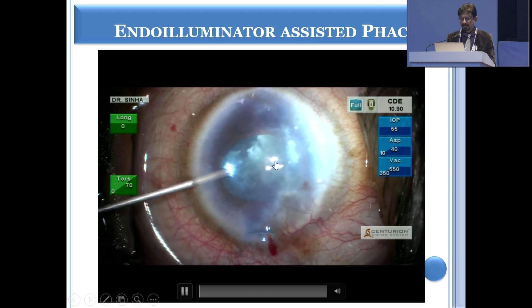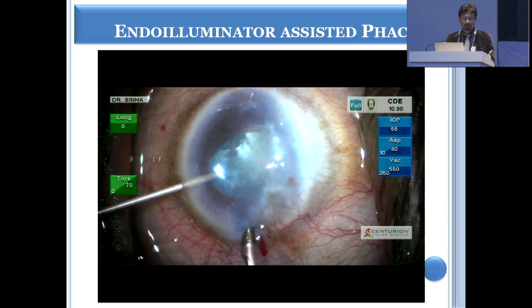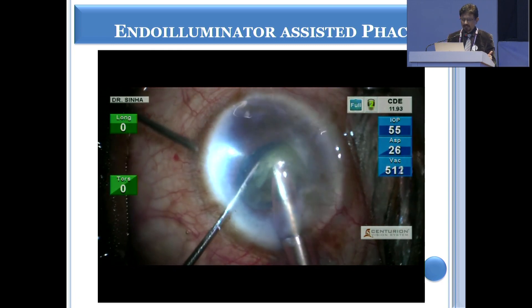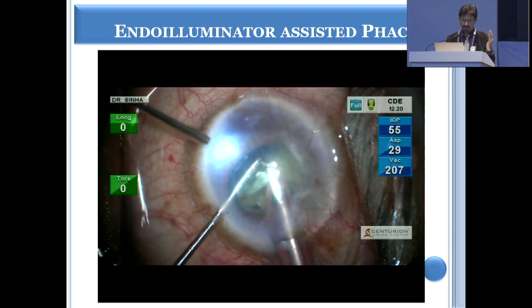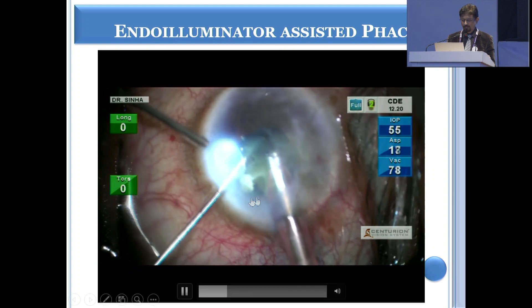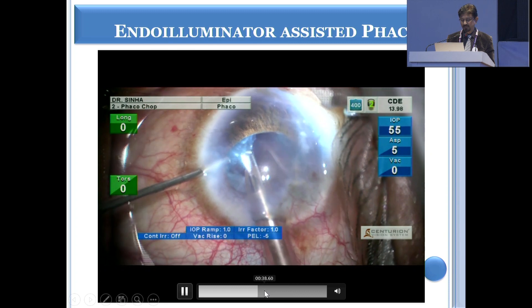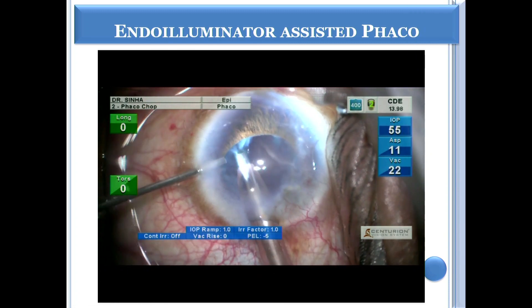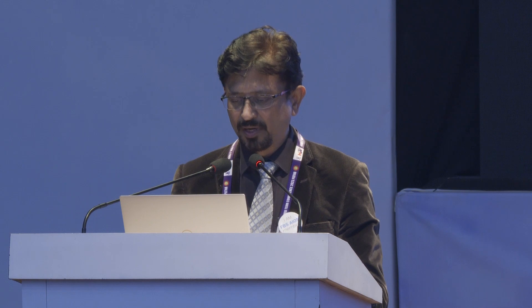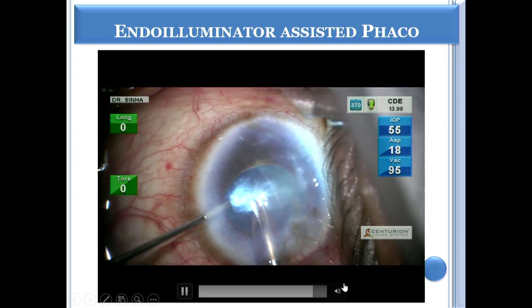The endo-illuminator is again a good tool which can improve visualization while doing a procedure in a hazy cornea. The endo-illuminator can be held by your assistant from outside while you are chopping the nucleus. And once you have chopped it and you have to remove the epinucleus plate, you can take the endo-illuminator inside so that you can very easily delineate the capsule and the epinuclear margin, and thereby remove the epinucleus completely without causing any damage to the capsule.